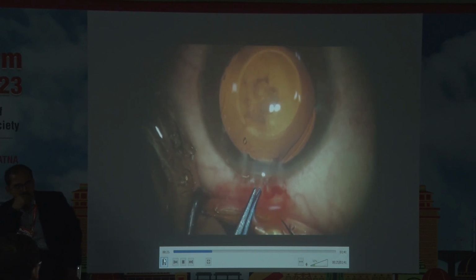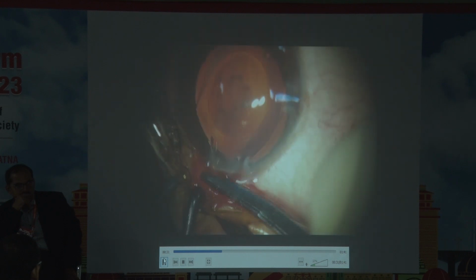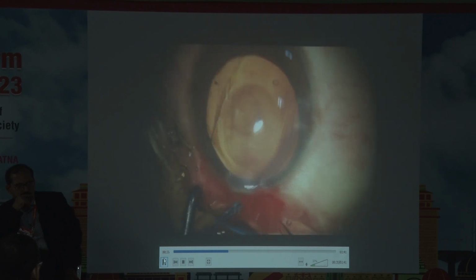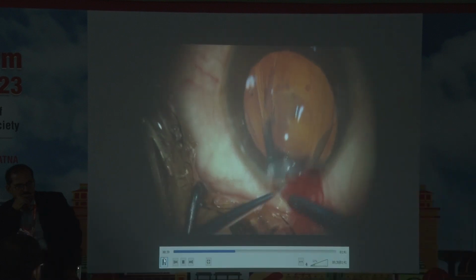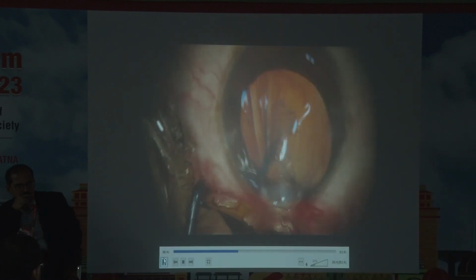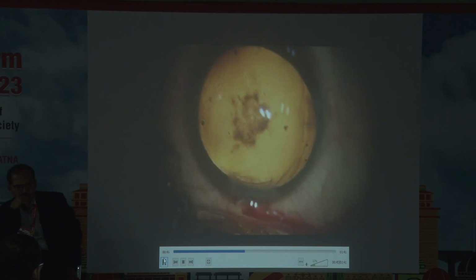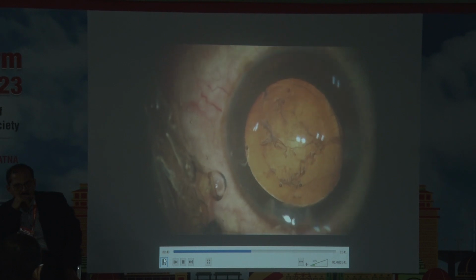So this was very obvious, right? The patient developed a cataract. So you see now this technique is very easy. The railroad technique or whatever you call it, you keep on grabbing, hand over hand. That's why I chose two: the one in which I did not know, the one in which I knew. And then once you remove the phakic IOL, it's pretty simple. It's a routine cataract later on.